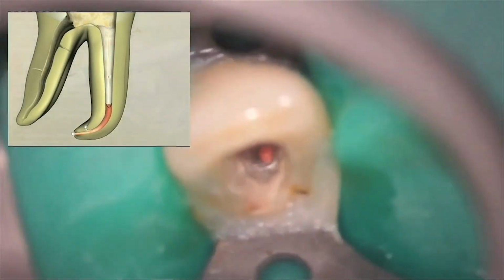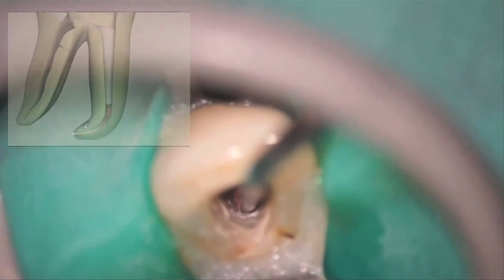And in my opinion, they have a much more difficult learning curve. Along with a greater number of steps required for traditional warm obturations, they're also much more likely to result in obturation and plugger voids. This is shown in the following x-rays.